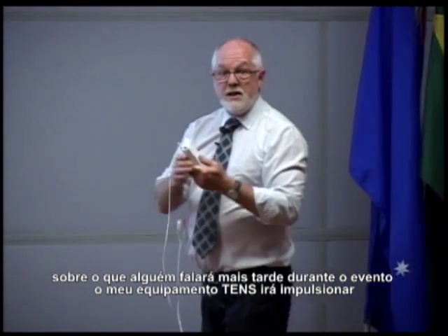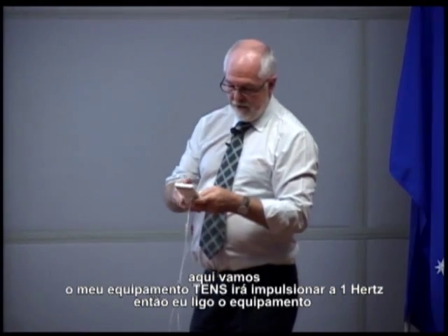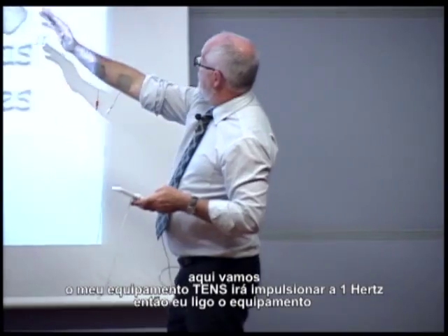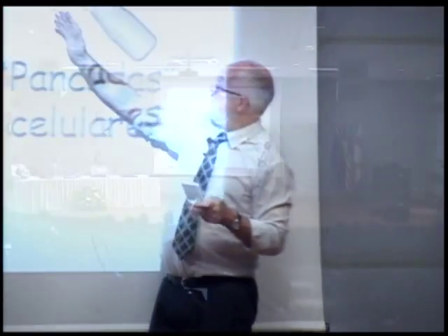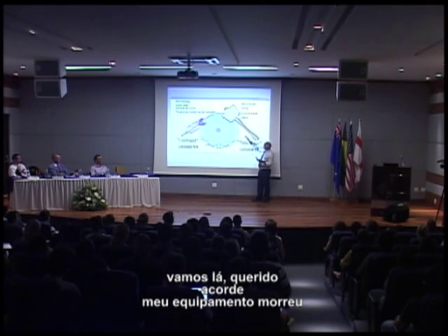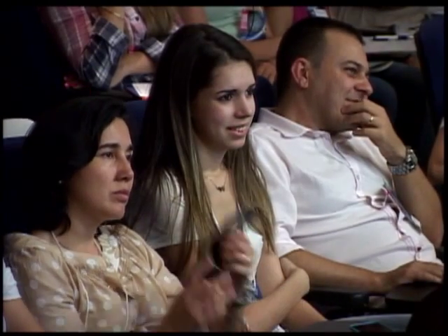So my TENS machine is going to fire at 1 hertz. So I turn it on. Come on, baby. Wake up. Now my TENS machine has died. Try again.